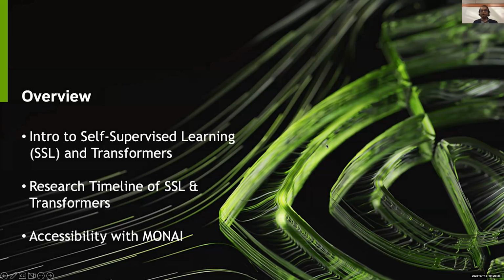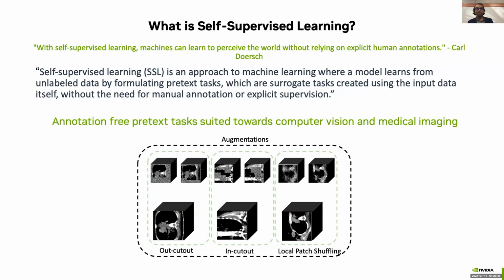So let's start with a quick intro on self-supervised learning and transformers, and then we'll take a look at the research timeline and then how you can access these resources with MONAI. So what is self-supervised learning?